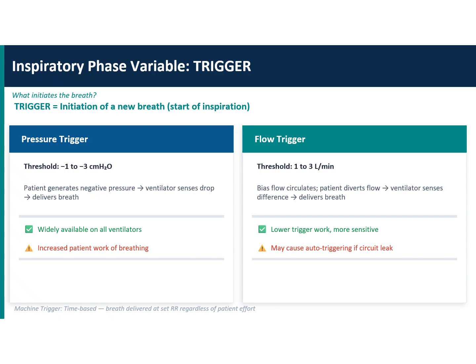You have kept a respiratory rate of 20, but there is some fluid in the circuit oscillating a little bit, creating some negative pressure, and the patient is getting breaths around 60 or 70 per minute. Sometimes even in cases with aortic regurgitation, with a very high diastolic runoff and high pulse pressure, the movements of the chest can trigger the ventilator. It is rare, but can happen.